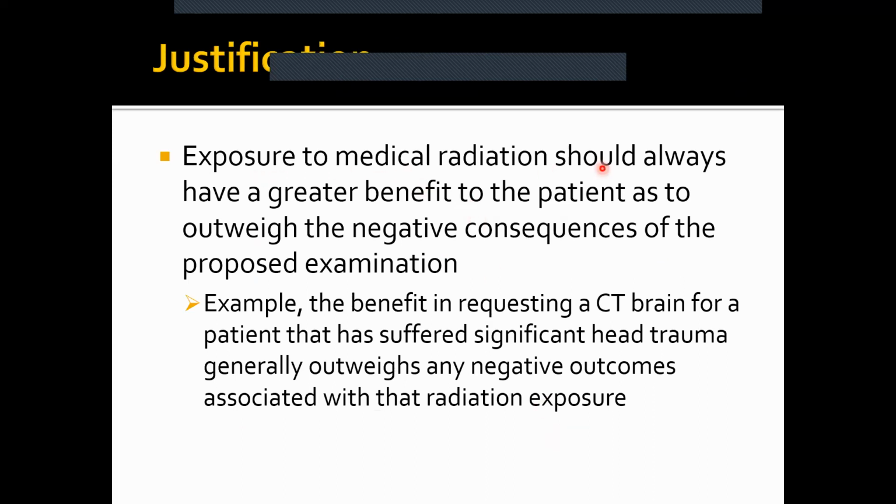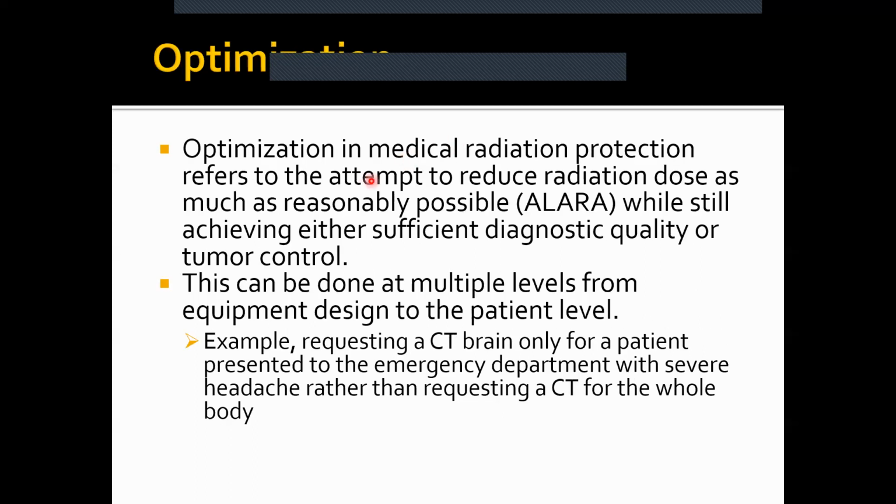Okay, so this is the justification. When you're exposing your patient to medical radiation, the benefit has to outweigh the risks. Pretty straightforward. Okay. Now, we can do optimization through the stuff we mentioned, such as the grids and the air gap.